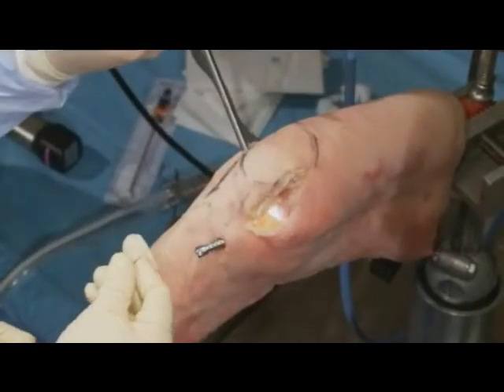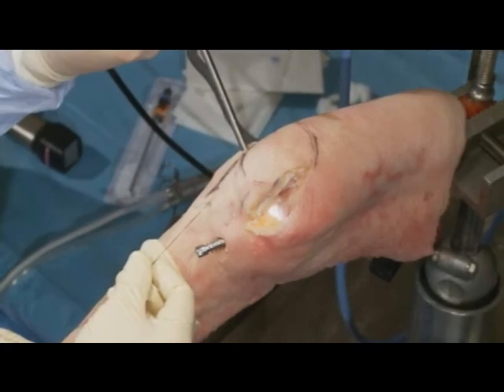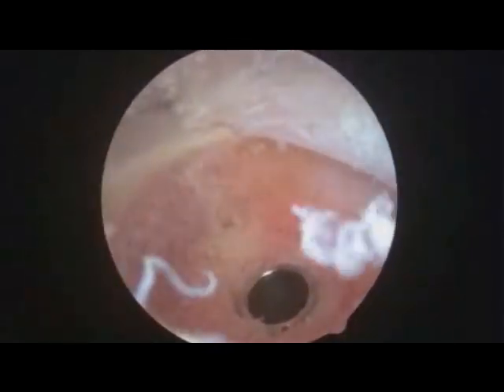Here you can see we have a nitinol wire that we're going to thread up through our screw. Can you give me an arthroscopy and an outside picture so I can show? We're going to thread this nitinol wire through the screw into the joint. I'm going to grab it from the joint. All right, so now I have the wire on the outside.